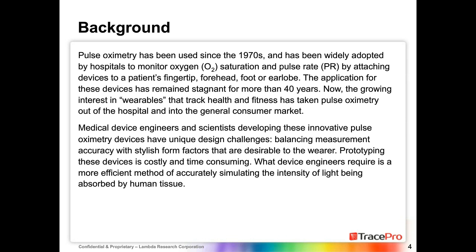How stylish is it? Who's going to wear it? When are they going to wear it? Are they going to wear it in direct sun? Are they going to be running a marathon with it? All of these things become a huge challenge for the engineer designing these devices. So we need a better way to be more efficient in our designing, and we need a better method of accurately simulating how light goes through these devices, gets absorbed by human tissue, and finally the oxygen content comes out in some form that we can use to accurately display to the user.